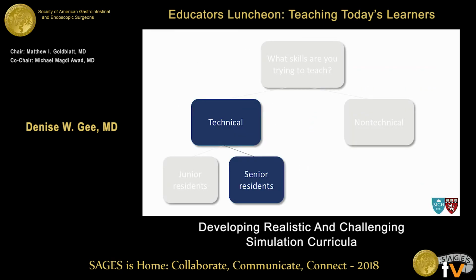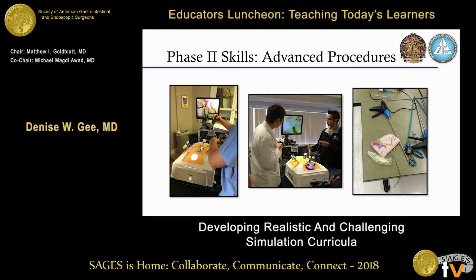Now, if you're teaching technical skills to more senior residents, obviously you have to kind of change your strategy a little bit. Again, start with a strong curriculum. So the Phase 2 skills in the ACS APDS curriculum is already there and is something they can easily follow. But you may need to consider more advanced simulators. And so we do have a lot of our industry partners also offer some of these models, but there are laparoscopic colectomy trainer, ventral hernia trainer, lap cholecystectomy.